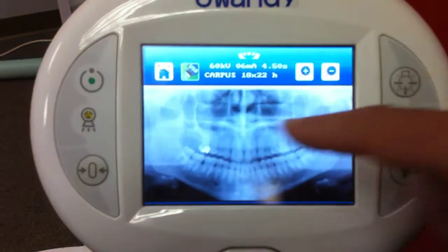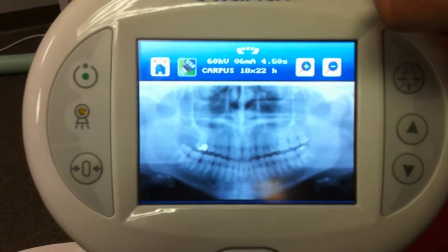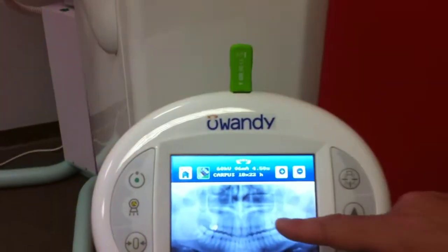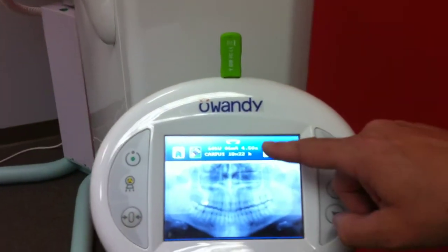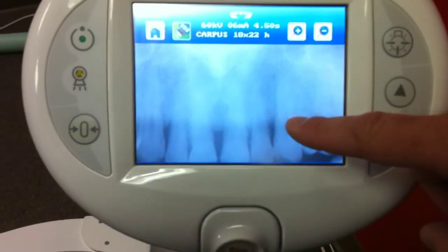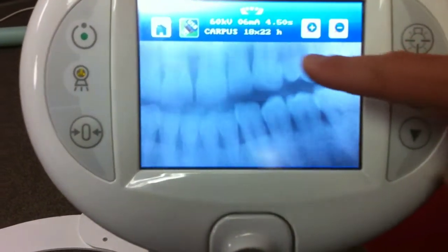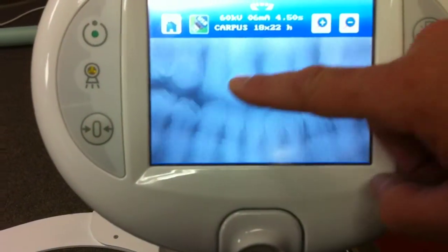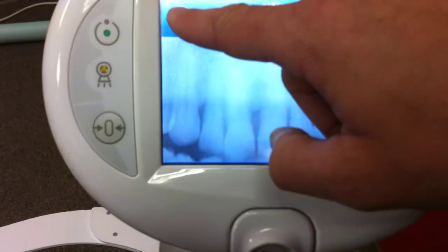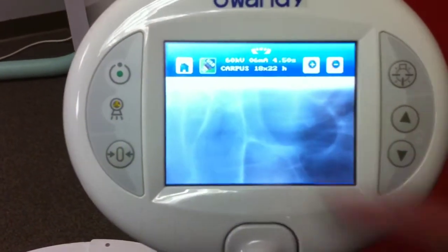When you're finished without using a computer, you can store the image on the USB memory stick. And you can use this to look at the image that you've just acquired to make sure you like everything. You can zoom in and move around. And when you're done doing that, you can go back to the home setting.